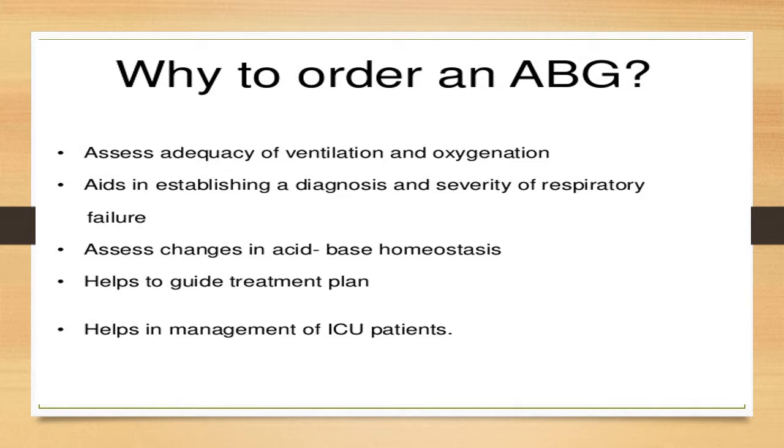Why to order an ABG? Assess adequacy of ventilation and oxygenation, aids in establishing a diagnosis and severity of respiratory failure, and it assesses changes in acid-base homeostasis, helps to guide treatment plan, and helps in management of intensive care unit patients.